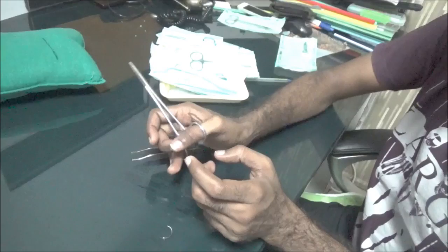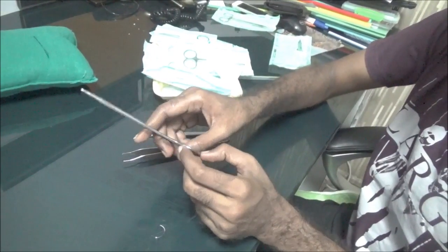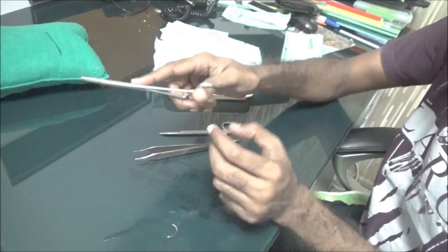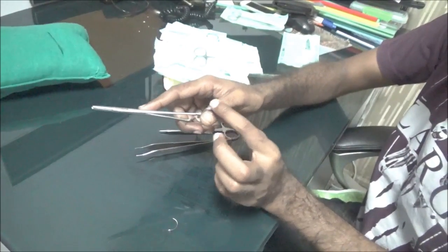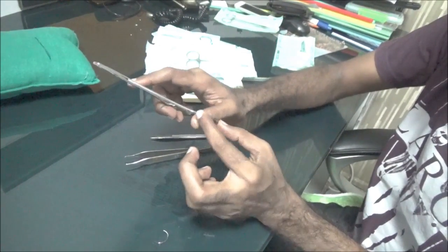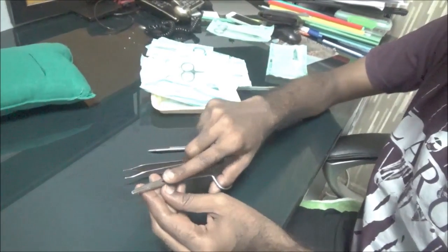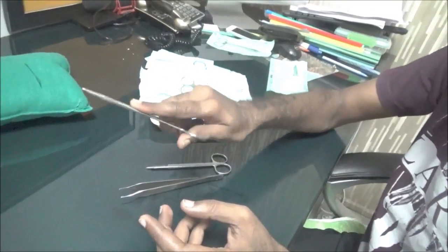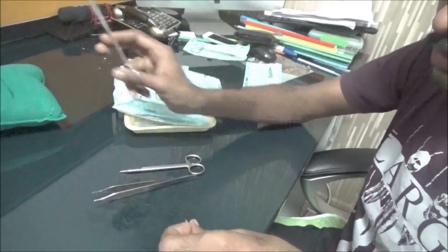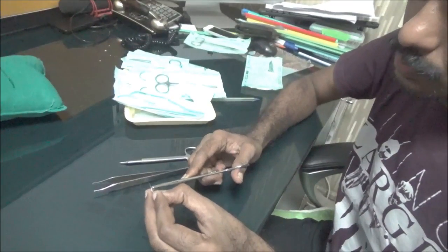An important point: the ring should not go beyond this joint. If it goes beyond the joint, it is difficult to release the finger. The key is using the needle holder with the ring within that space — it should not go beyond.